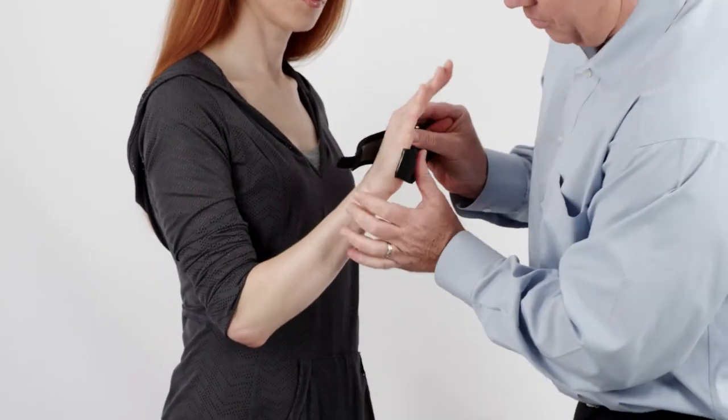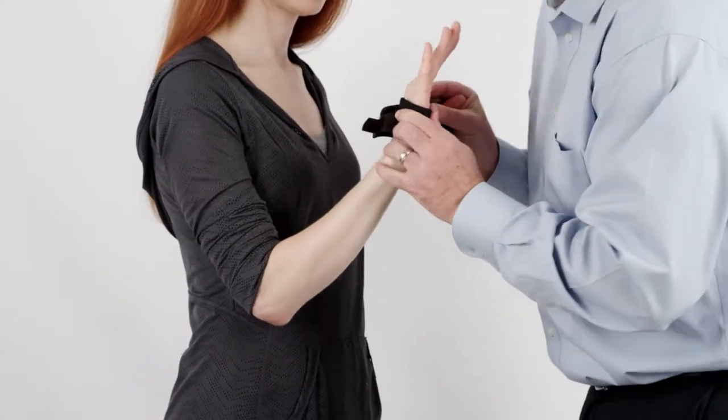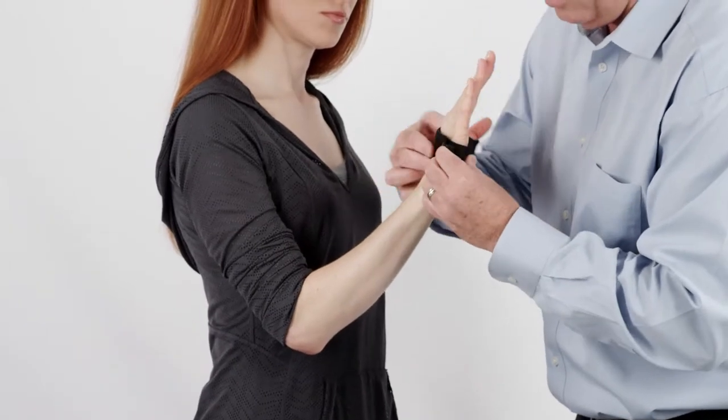Gently apply thumb and hand. Gently pull the underlying tab to remove slack from the material in the palm.